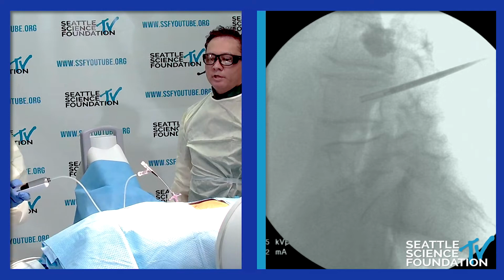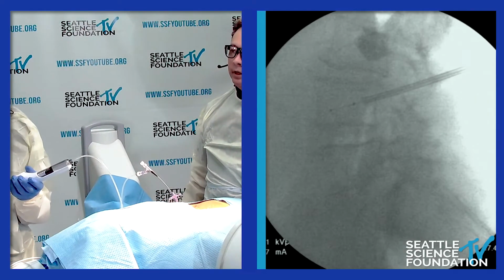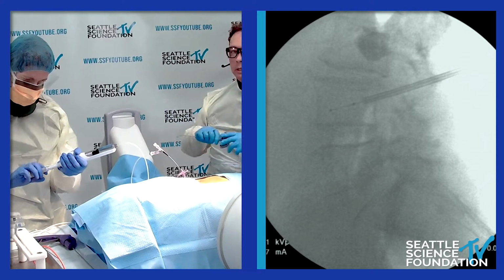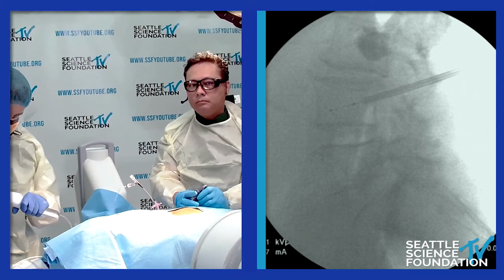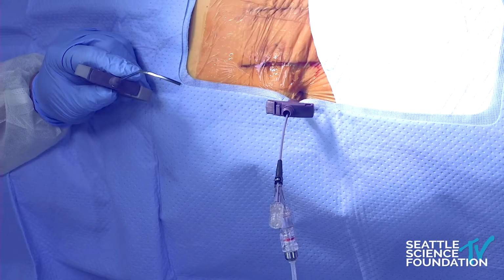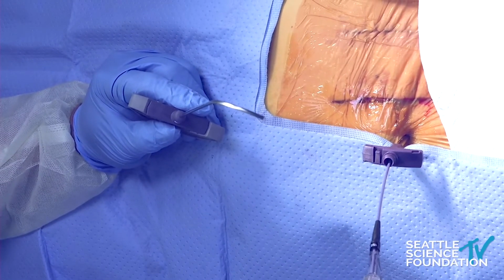But there's an alternative at this point also to go to a curved needle rod to bring it even further across. So we can get even further across in a unipedicular manner. But do you really need the balloon now, Glenn? If you're trying to provide some height restoration, this is the only way we're going to be able to do that, at least for balloon kyphoplasty.